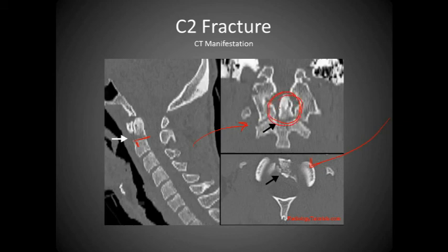We see this fracture here and narrowing there versus widening there. Notice that we don't have really any abnormality with the spinal cord, though. So this patient would definitely be taken for surgery. But the prognosis is not as dire as some of the previous images possibly.